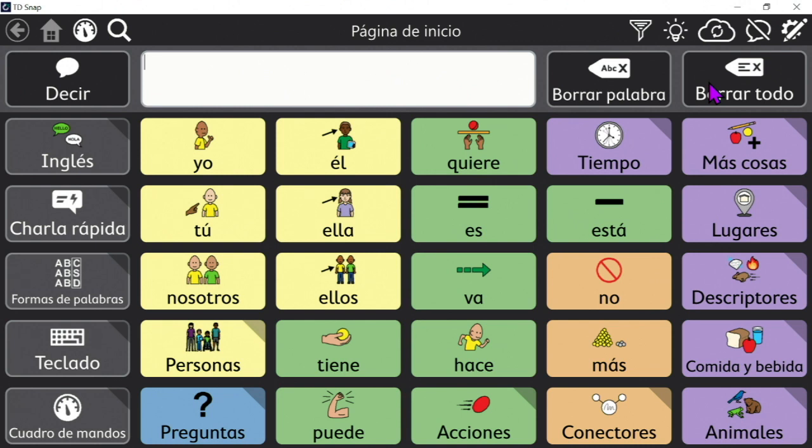Okay, so this is a very brief overview, but I just wanted to talk a little bit about some of the differences and some of the key features in Motor Plan. Again, we do have a lot of other things to add, so feel free to either stop by the booth, you can ask Lauren and I, or you can head to our session tomorrow morning. It is bright and early, right at 8:30, so feel free to join us if you're interested. And if you're not interested in that early morning, you can come and talk to both Lauren and I, or you can head over to the booth.